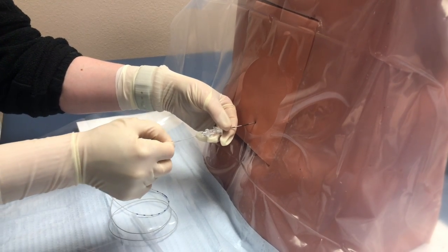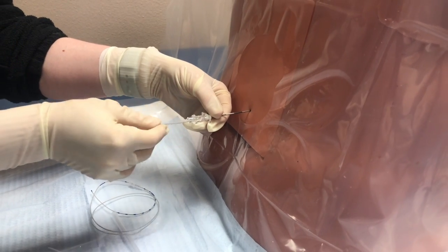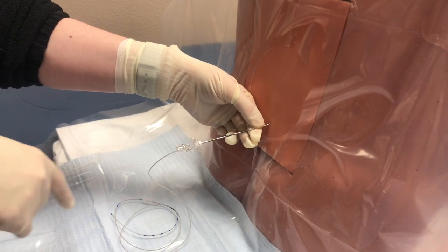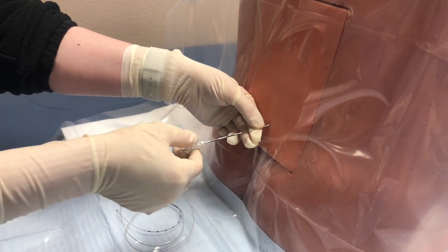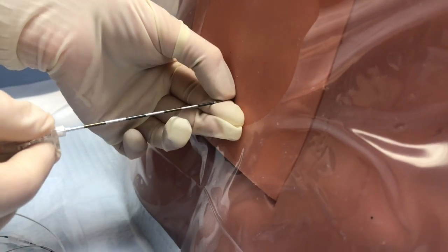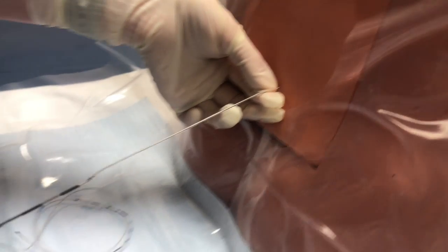An epidural catheter is threaded through the needle and into the epidural space to a depth of 3 to 5 centimeters. Once the catheter is threaded to approximately 3 to 5 centimeters, the needle is withdrawn slowly over the catheter. Once the epidural needle is removed, the catheter depth should be noted and documented.